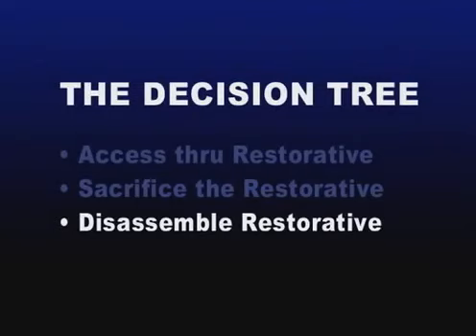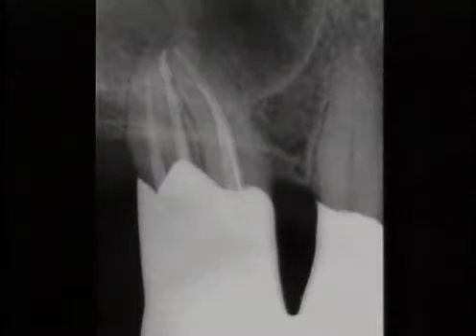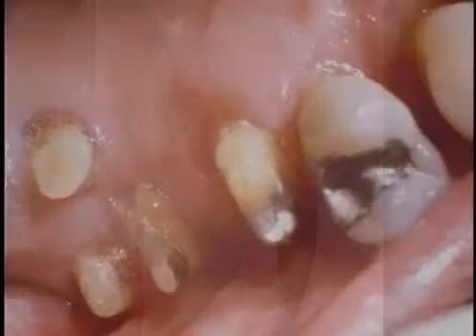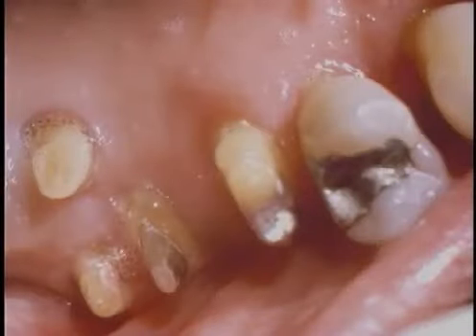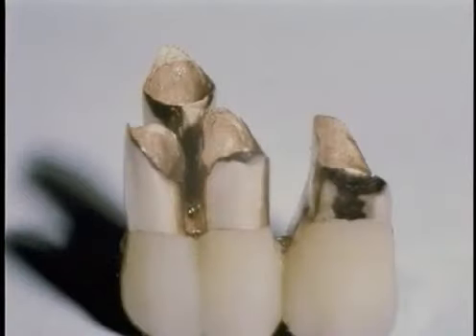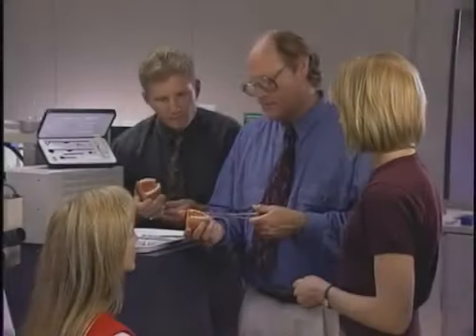On some specific occasions, it may be desirable to preserve and remove existing restorative dentistry. If the dentistry meets or exceeds the restorative criteria for excellence, then the decision to remove any restoration is based primarily on the access required to facilitate endodontic disassembly and retreatment. Clinicians must consult with their patients and clearly define the risk versus benefit when considering the intact removal of existing dental restorations. We'll talk more about that later.